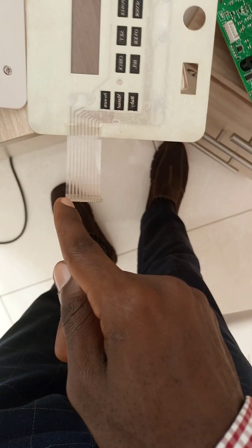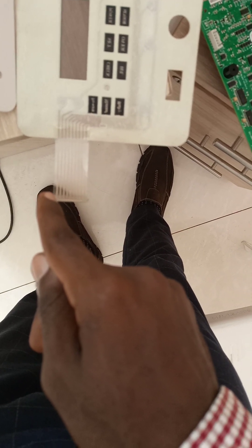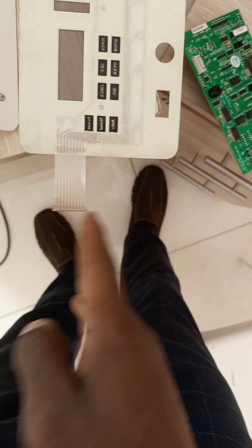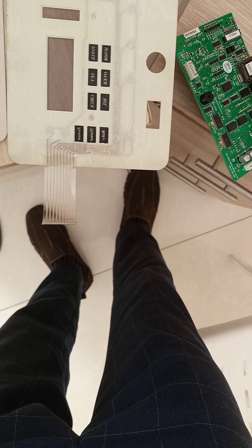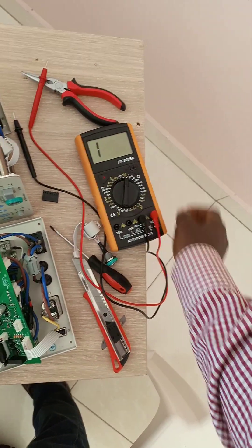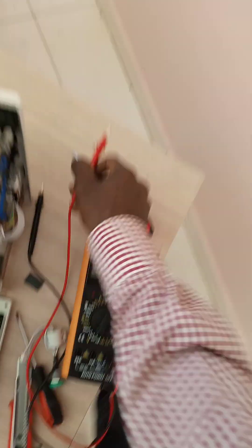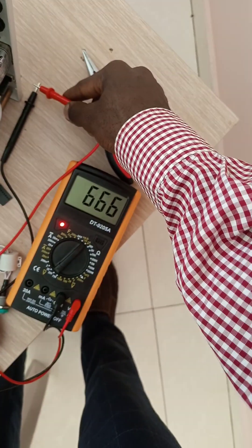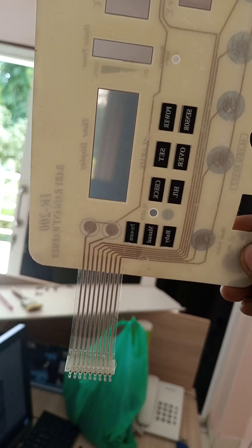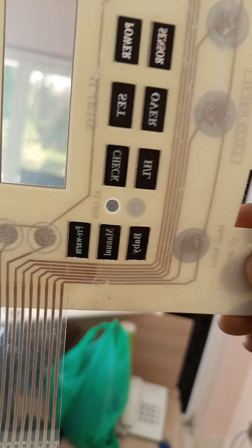I measured the continuity between each of the components — between one and the rest, then another and the rest, checking each one. It turned out there was no continuity; my multimeter was not sounding the alarm. I initially thought it was fine, but when I looked at it under light I noticed something.